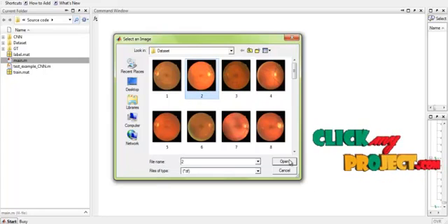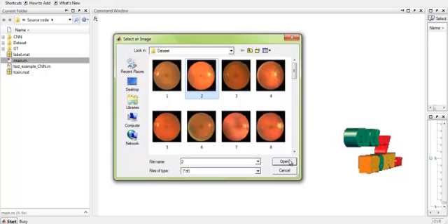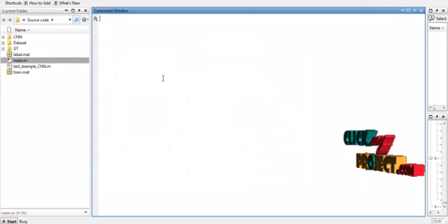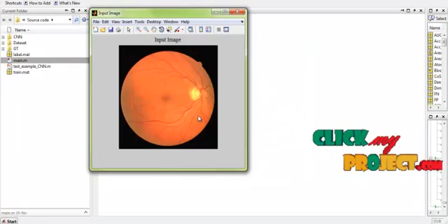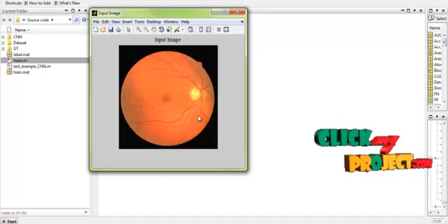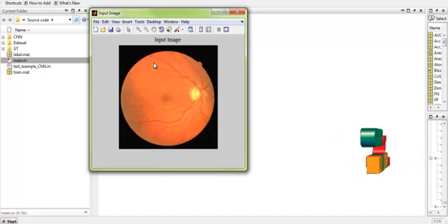We have selected a fundus image. The process goes on. This is the input fundus image that we have selected.